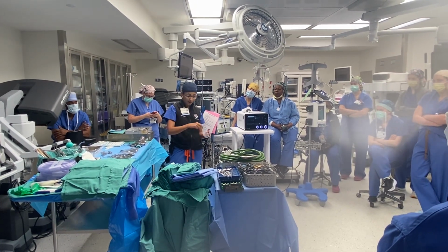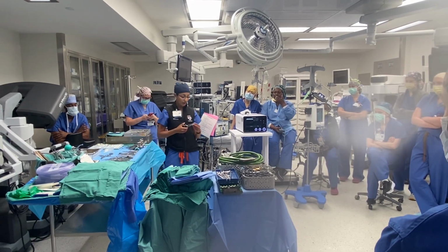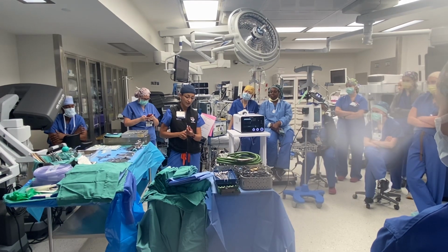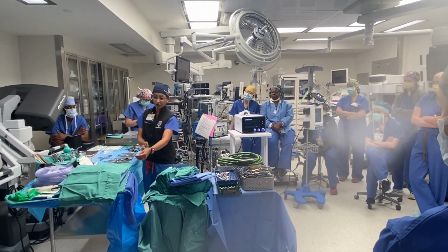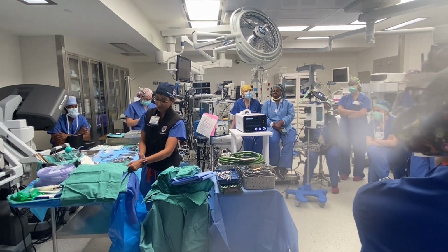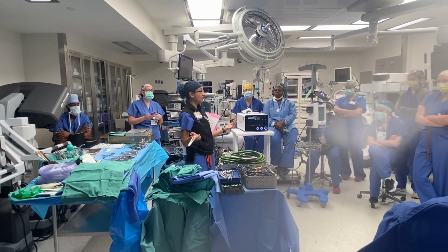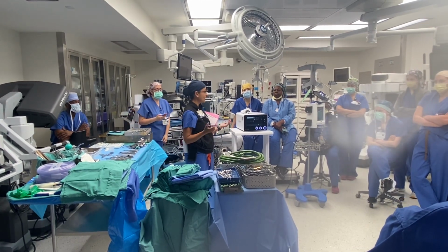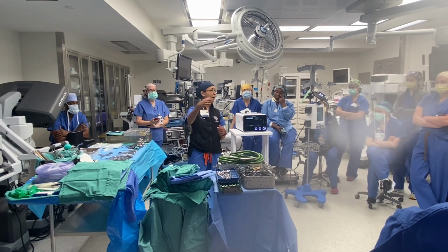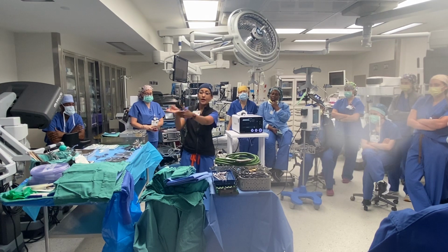And then once we cut that galea, we'll use these Rainies, and the Rainies allow us to basically tamponade. So we'll crack these open, shove them across the scalp like that, and then pop them. And we go, as you guys know, pretty quickly with that because the scalp bleeds a ton. We don't want to lose a lot of blood in just that initial portion of the case. So we're just going to go pop, pop, pop, both on the top part of the skin and the bottom part of the skin and all around.